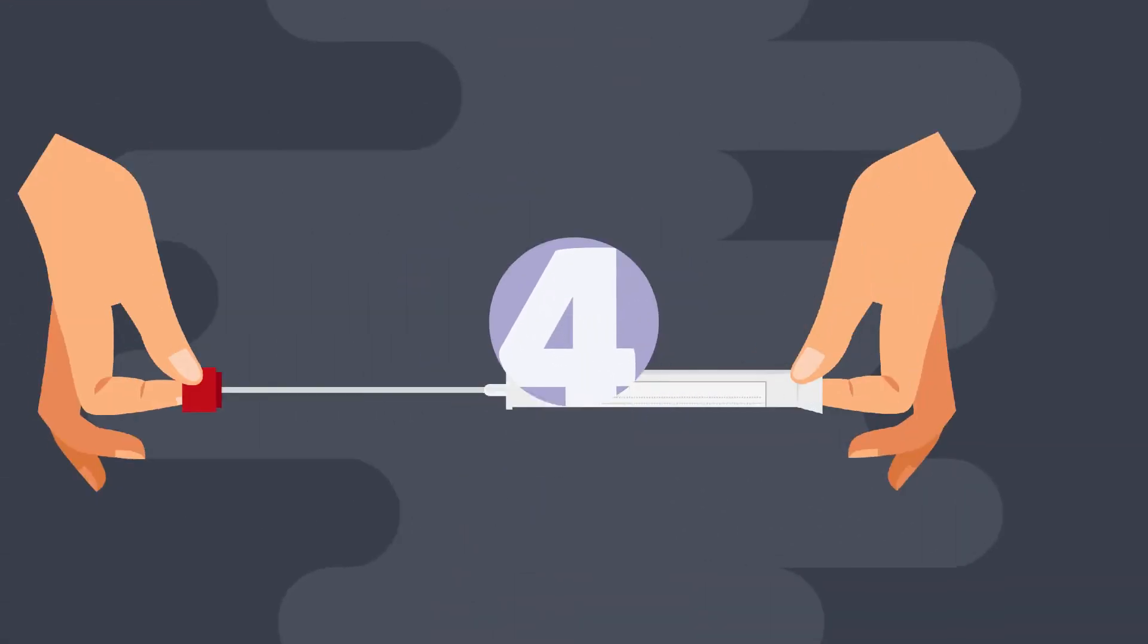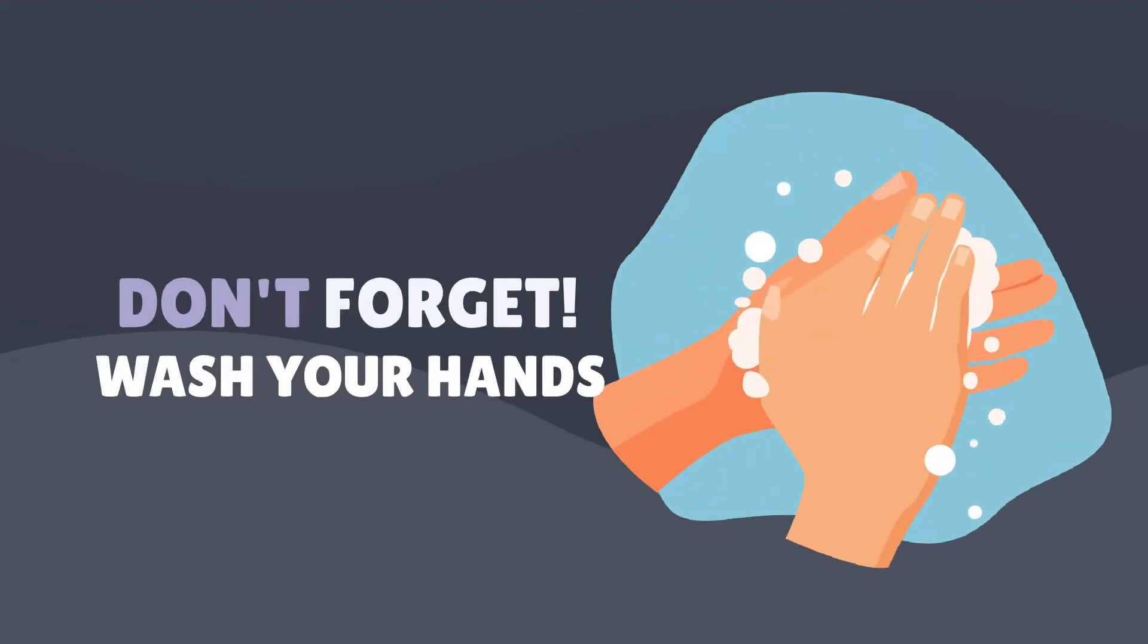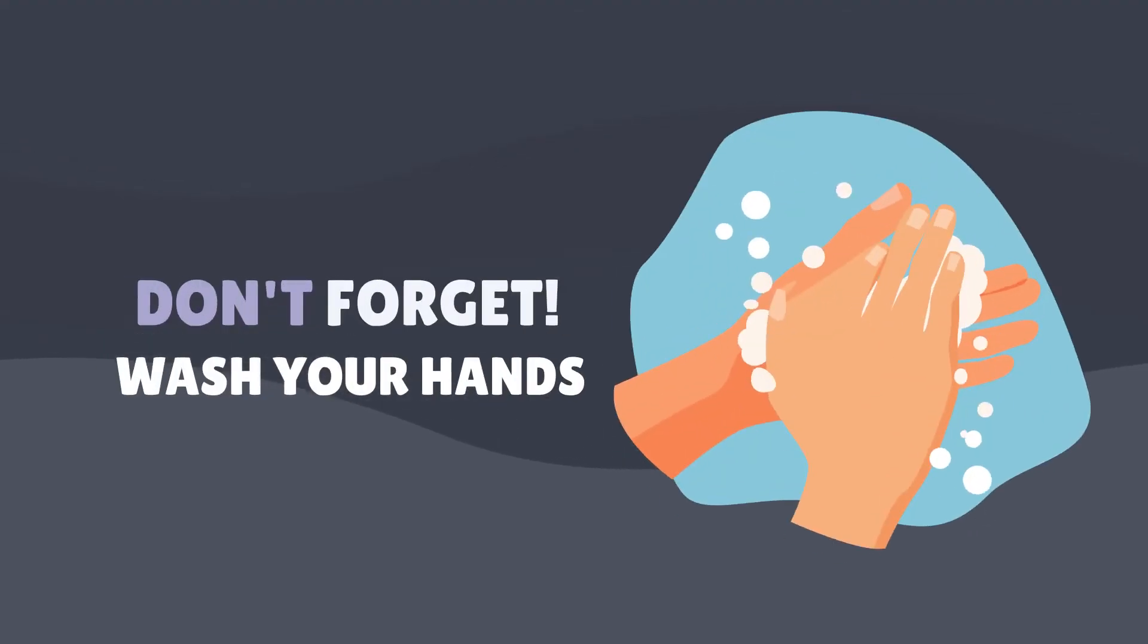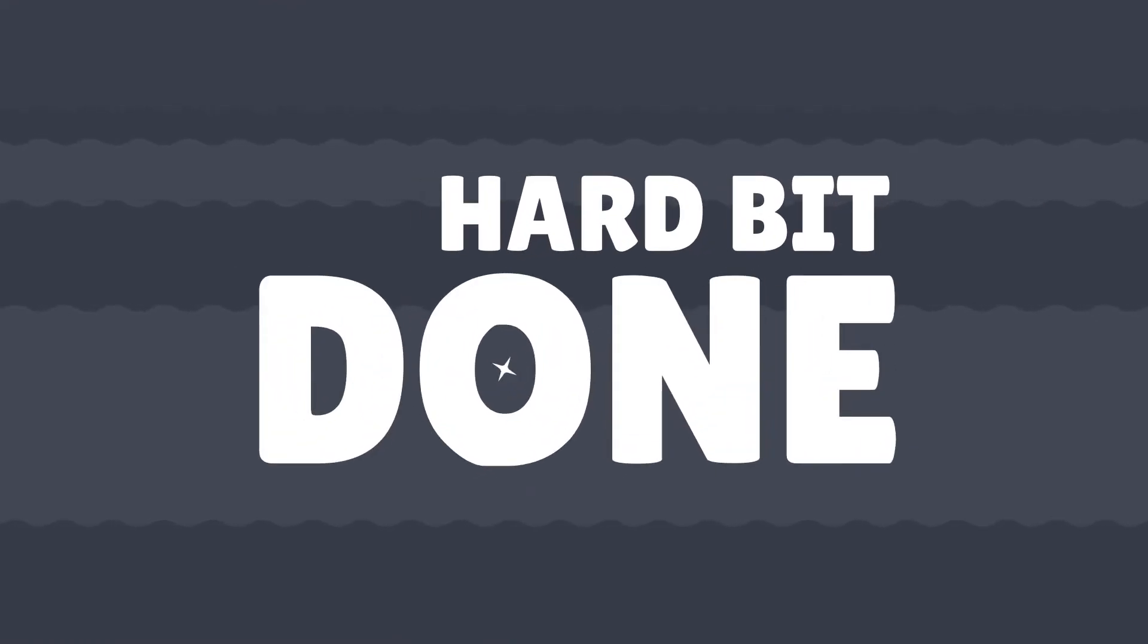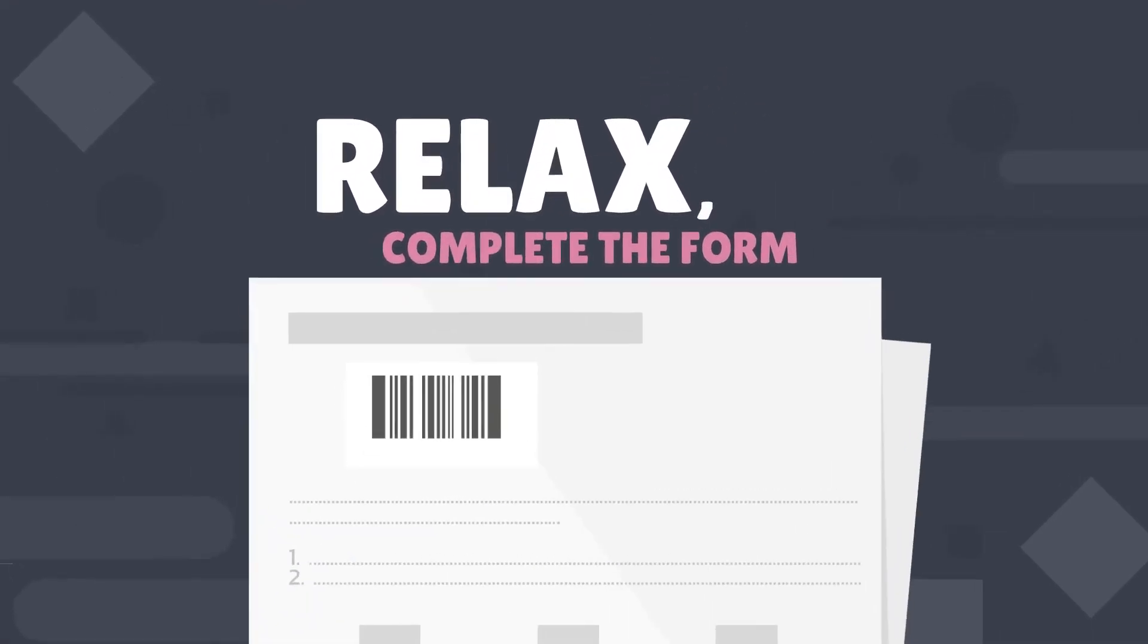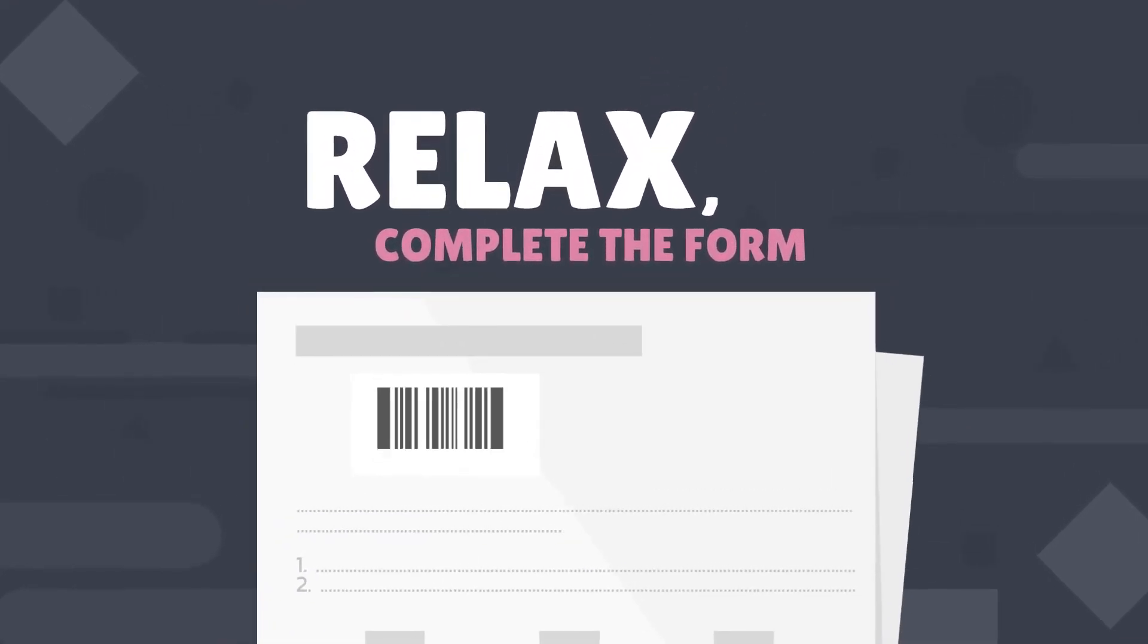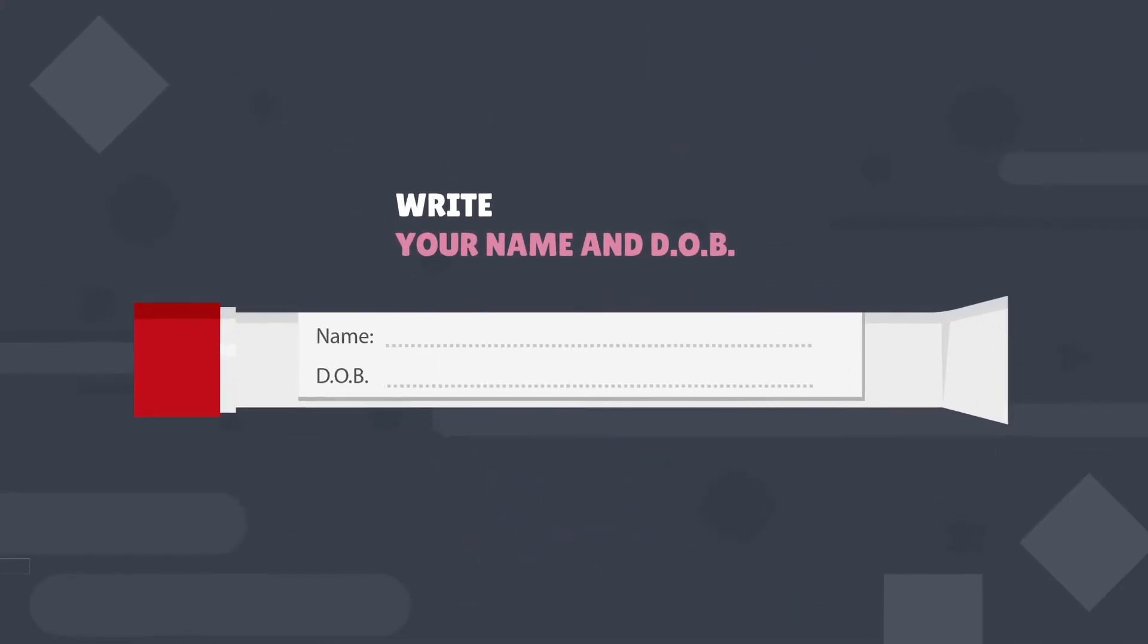Step 4: Place the used swab back in the tube and close tightly. Don't forget to wash your hands. That's the hard bit done. Now relax, complete the form you found in the kit and write your name and date of birth on the swab tube.